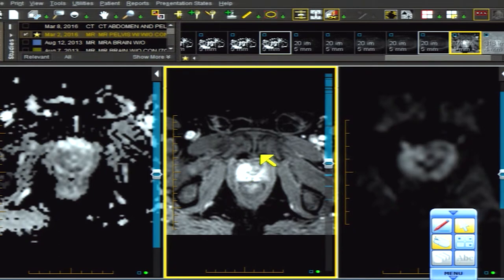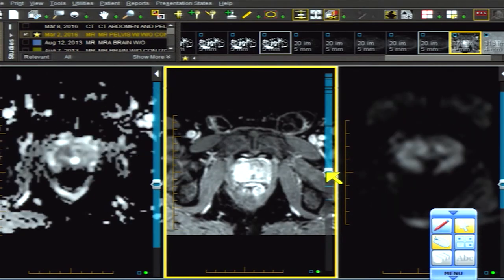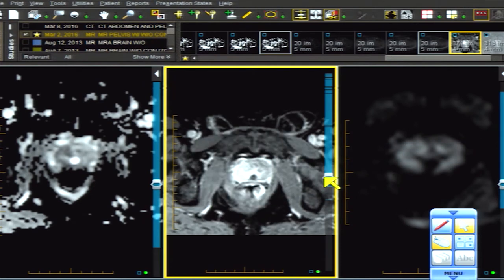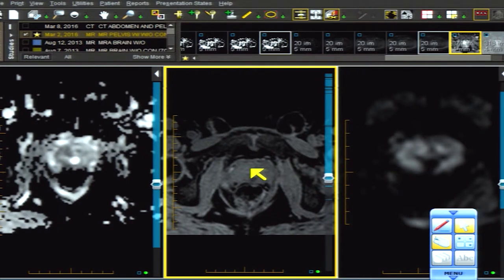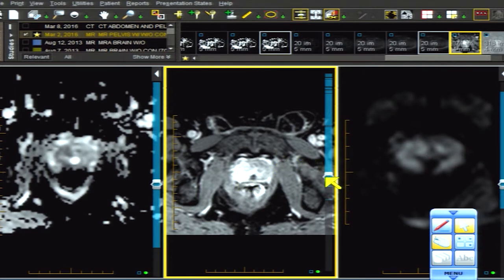The lesion abuts the capsule for greater than 1.5 centimeters and does so on all sequences — it's a PIRADS 5 all the way around. Going higher up near the base of the prostate, closer to the base of the bladder: there's the positive ADC map, there's the positive DWI image with a B value of 1600. The right gland is certainly a lot different and a lot brighter than the left gland, with little fingers infiltrating through the capsule and an area of capsular abutment greater than 1.5 centimeters — it's a PIRADS 5.